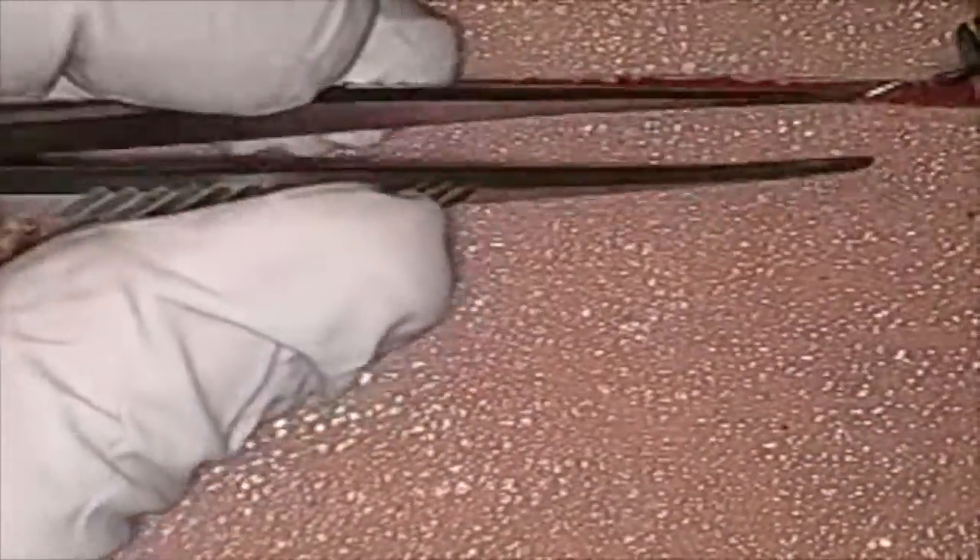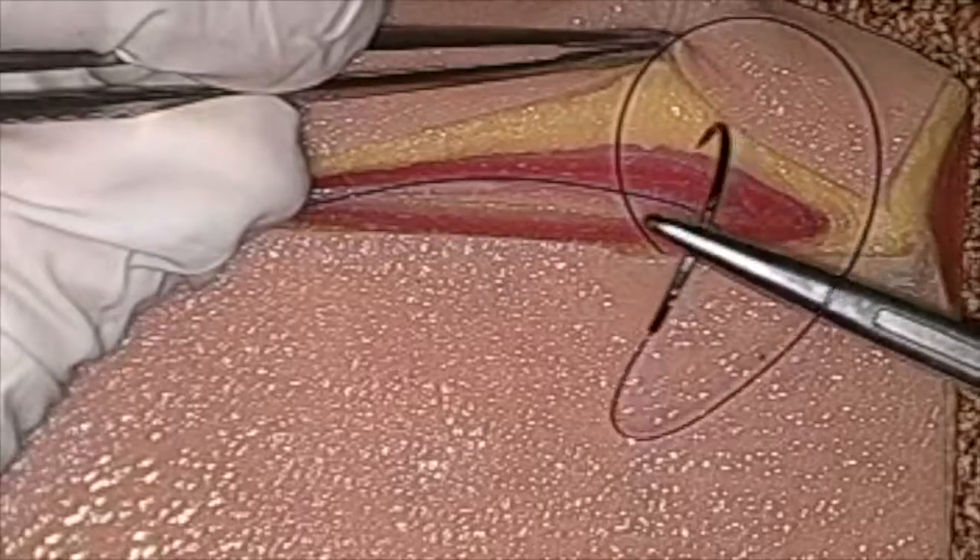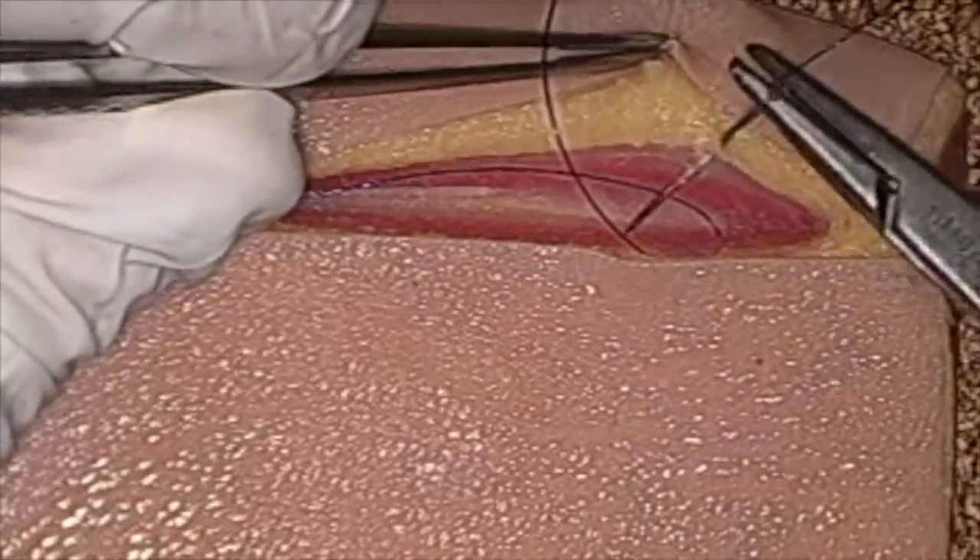You can use each layer differently. In this situation, I'm just practicing a buried knot. You can also do it without doing a buried knot if we want to make this like the linea. It would be good to practice both continuous and interrupted sutures in this manner.